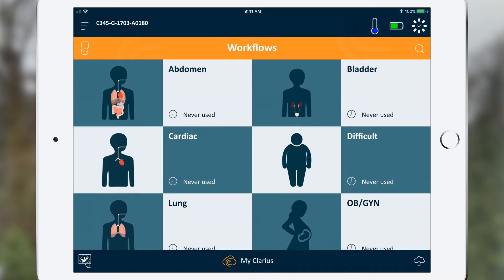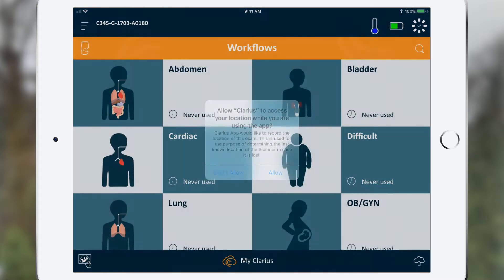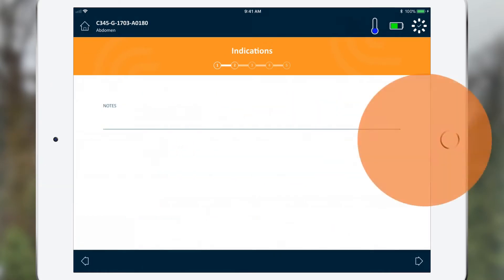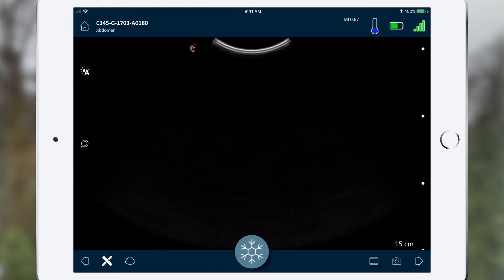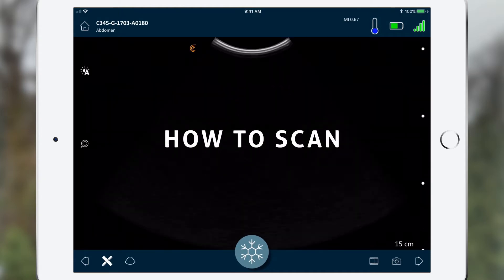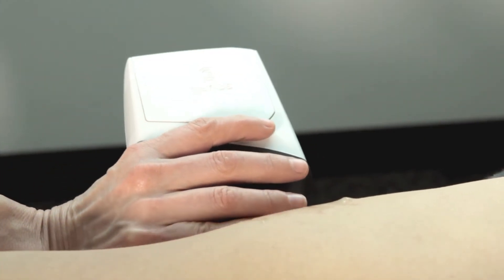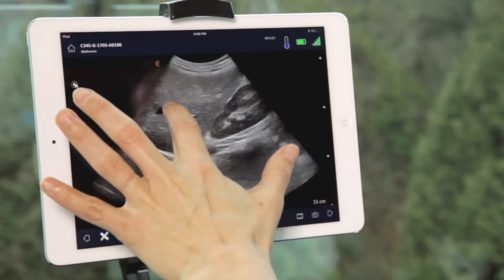You are now ready to begin scanning. First, select an exam type from the list. The next screen will ask you to enter in patient demographics. You can skip to the next step. Your scanner is now ready to scan. Put gel on the probe face before placing it on the targeted body part to scan. Your image will appear on the screen.